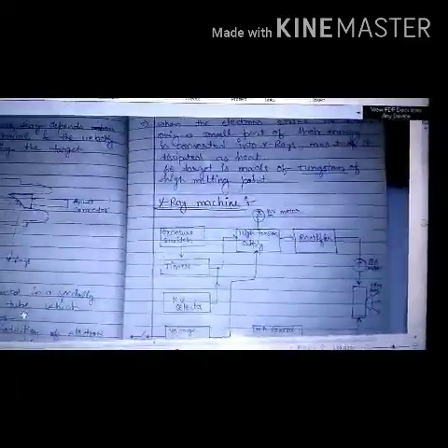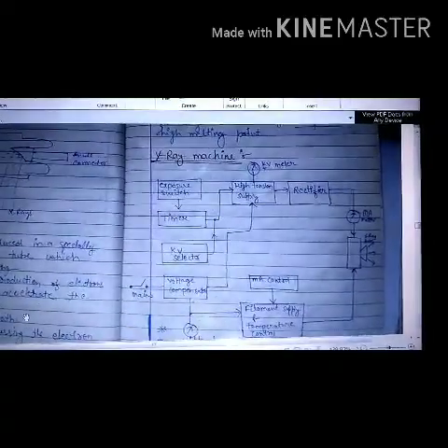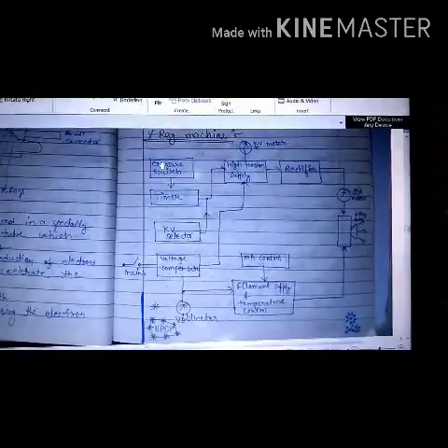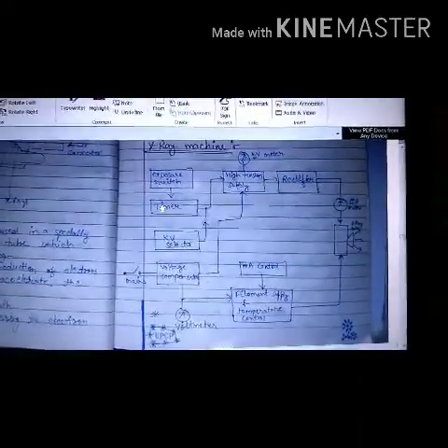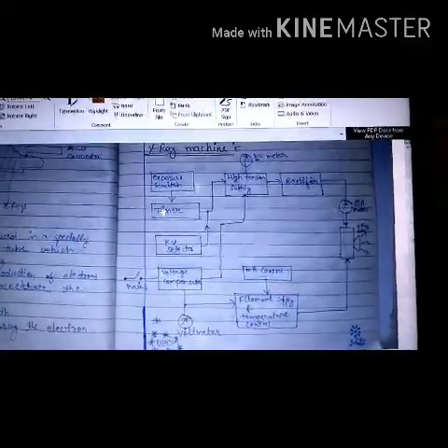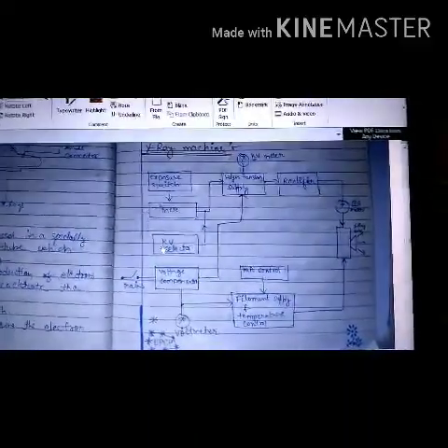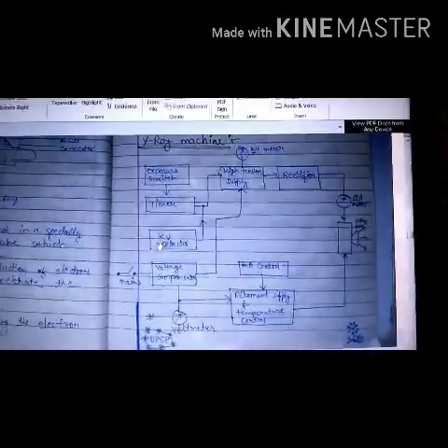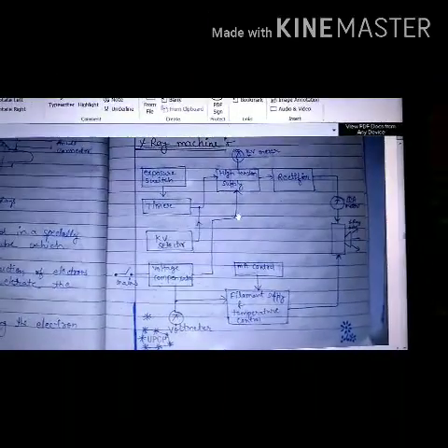Now this is a very generalized structure of an X-ray machine. We can see there is an exposure switch and timer which controls how much time X-rays can be emitted and used, because X-rays are harmful to us. Now this is the kilovolt selector, which selects which sort of X-rays we want. Okay, this is the voltage compensator circuit.